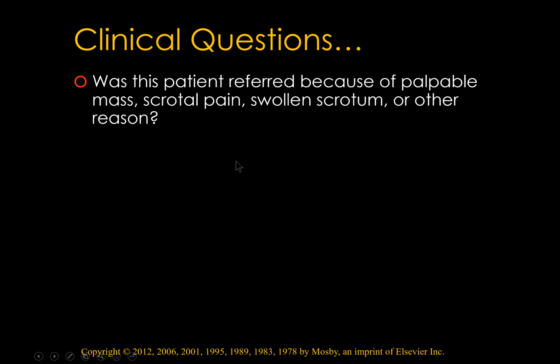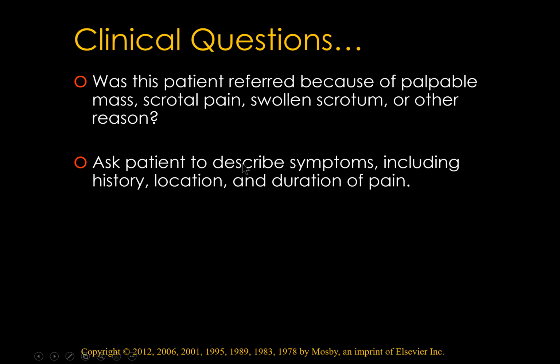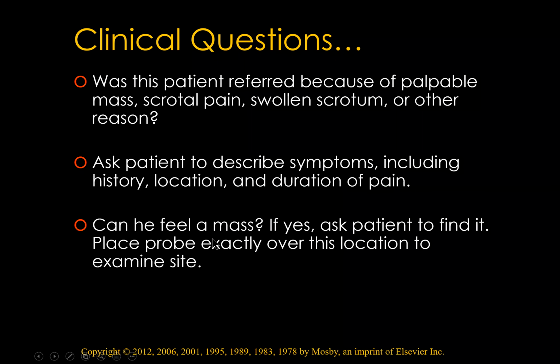Ask the patient to describe symptoms, including history, location, and duration of pain. Also, ask the patient if he can feel a mass. Ask where the mass is. And when you locate the area of the mass, put the probe on it. Place the probe exactly over the location of the examined site.